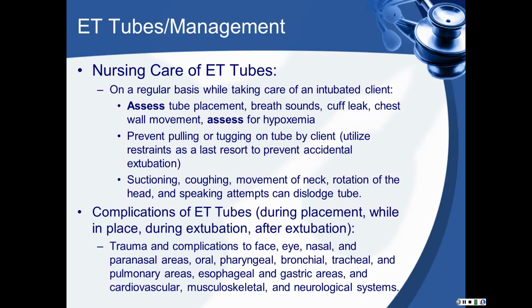But on a regular basis, while taking care of your intubated client, assess that placement, assess breath sounds, check for cuff leaks, chest wall movement, and any signs or symptoms of hypoxemia. We only want to utilize restraints as the last possible resort if your patient requires them for accidental extubation. Suction as needed.